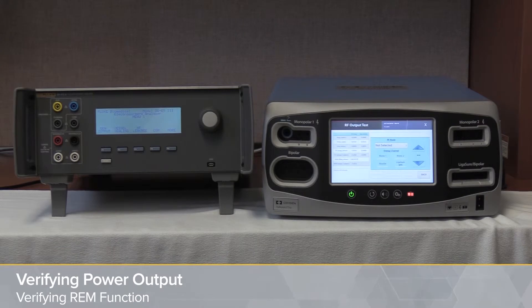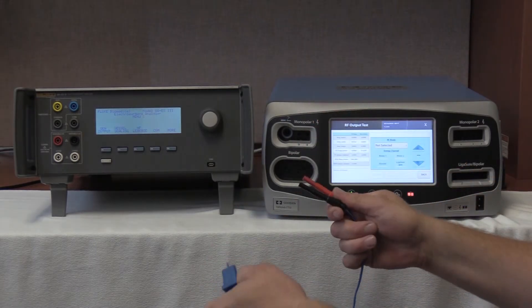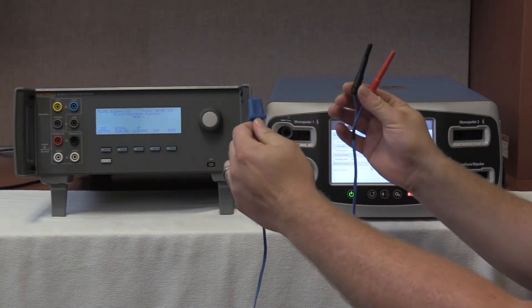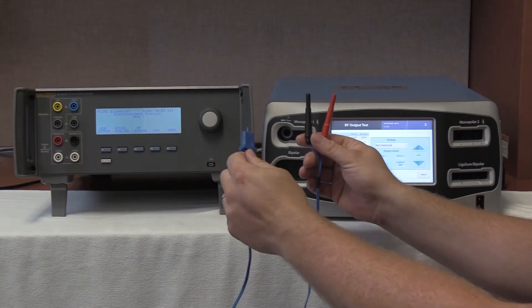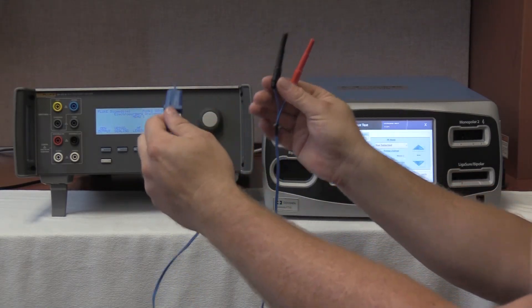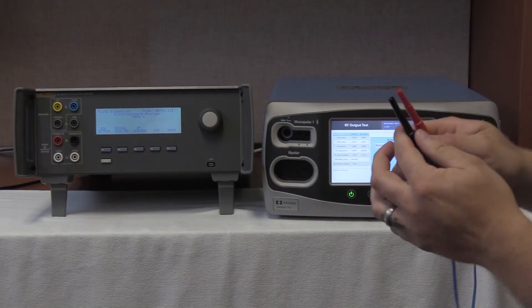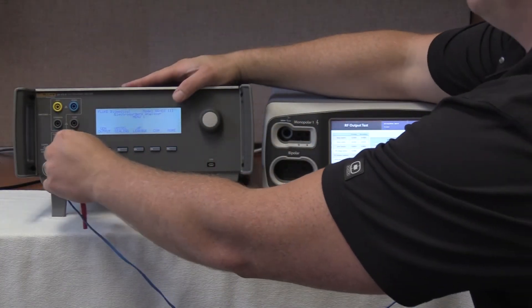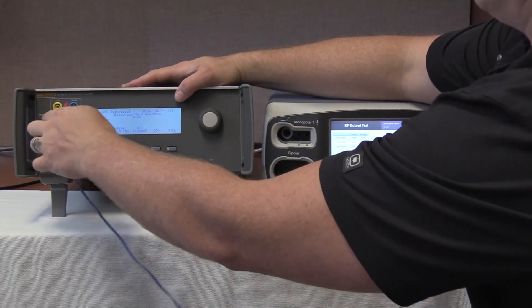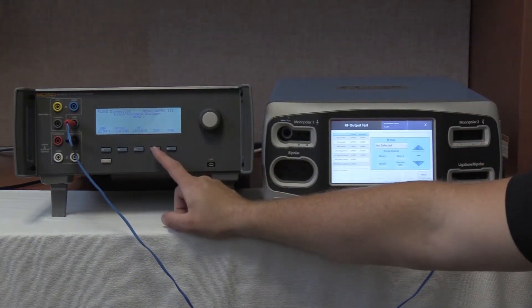We are now going to verify the REM function according to the service manual for the Valleylab Covidien FT10. This procedure is found on page 6-20 of the service manual. To perform the REM function test, we are going to use the 2-lead REM pad cable found in the QES3 — on the QES3 you will title this CQM, as in contact quality monitor. You take the dual pin REM/CQM adapter, plug it into the REM port of the Valleylab Covidien FT10, plug the black port into the variable low port of the QES3, and the red cable into the CQM port of the QES3. Once plugged in, select the CQM contact quality monitor test.